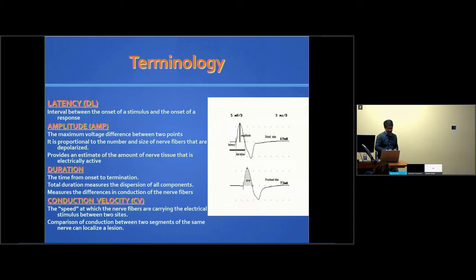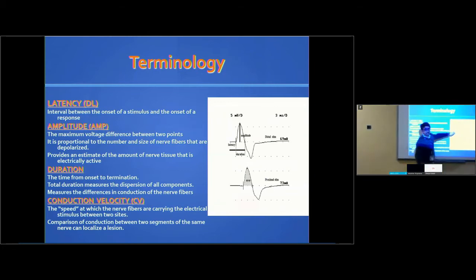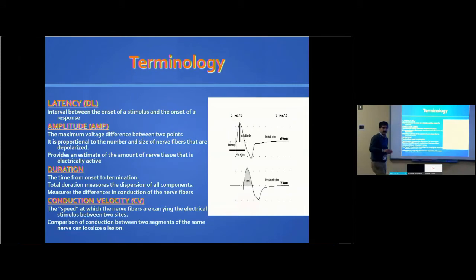So that's distal latency. Amplitude is the deflection, so the negative peak that you will see. And we measure it by either from the baseline to the peak or peak to peak. So we have normals for each age group, and then when we are reporting, we are also coding whether it's normal or abnormal.